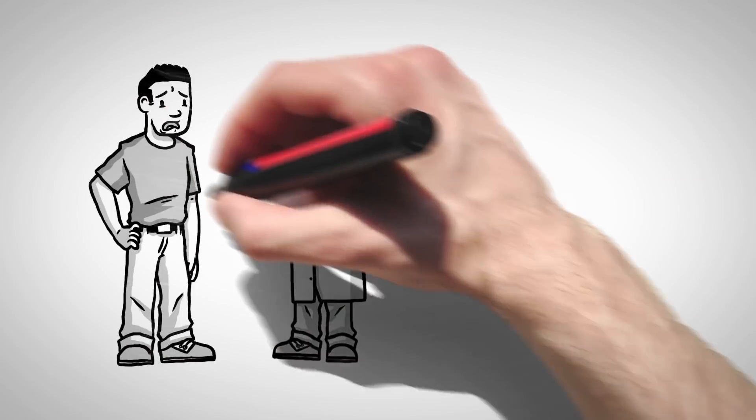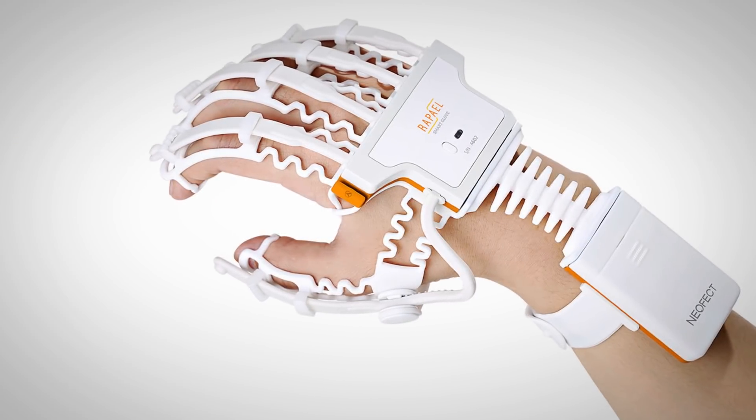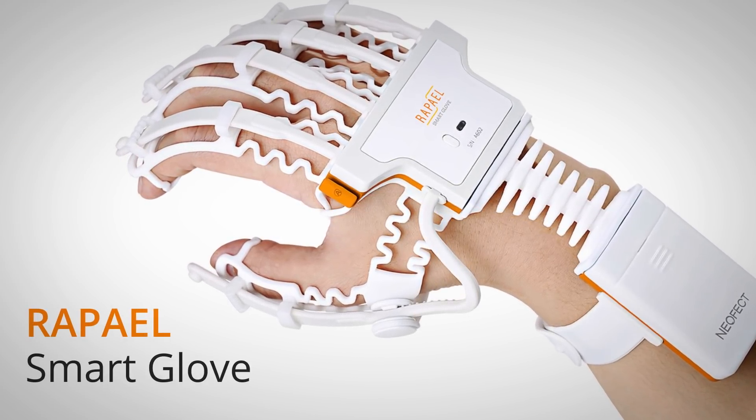Has a stroke left you struggling to regain full functionality in your arm or hand? Introducing the Raphael Smart Glove, a biofeedback training device from Neofect USA.